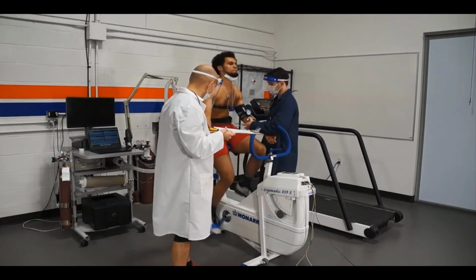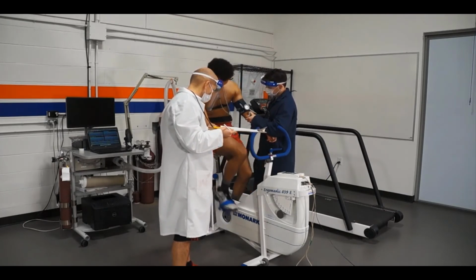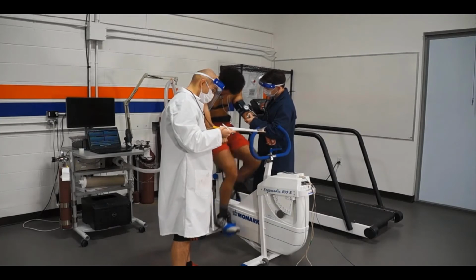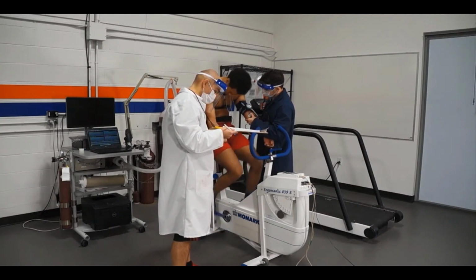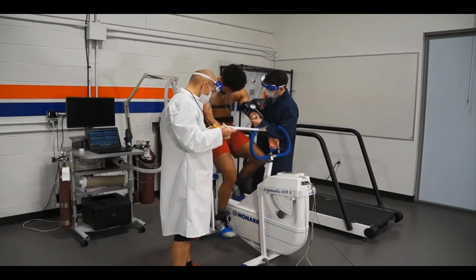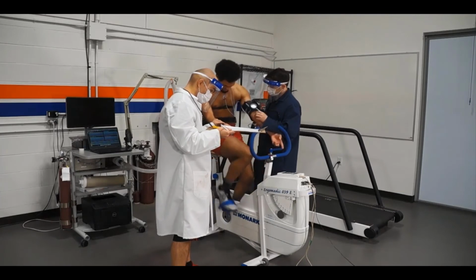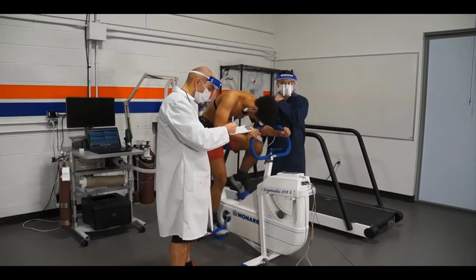They take 2 steps up, and like we see here, participants start to work pretty hard. This is where it really takes taking good measurements, especially with blood pressure and manually palpated heart rate. Participants are really moving all over the place, and you don't want to take extra long because you're only prolonging the test and then not having as much data in the next workload.